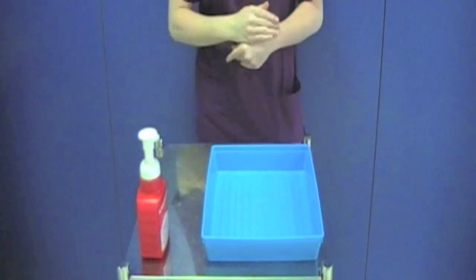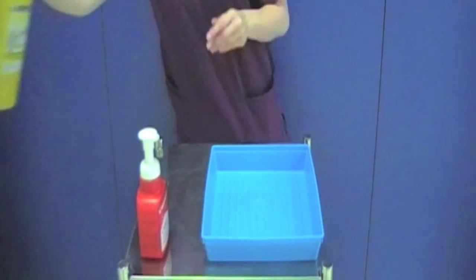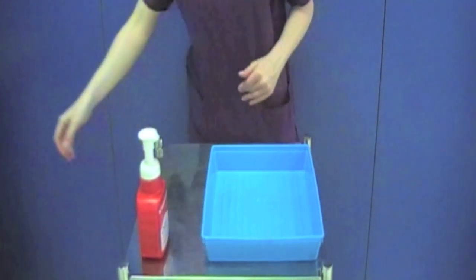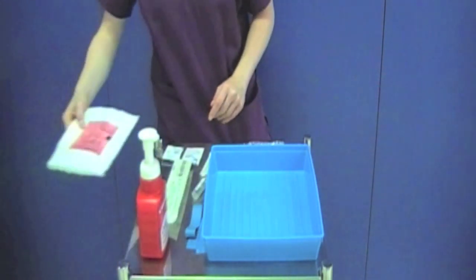Decontaminate your hands and wait for the tray to dry for 3 minutes. During this time, you can gather the equipment onto the trolley. Make sure that there is a sharps bin to hand. Do not put the unopened equipment in the tray at this point.